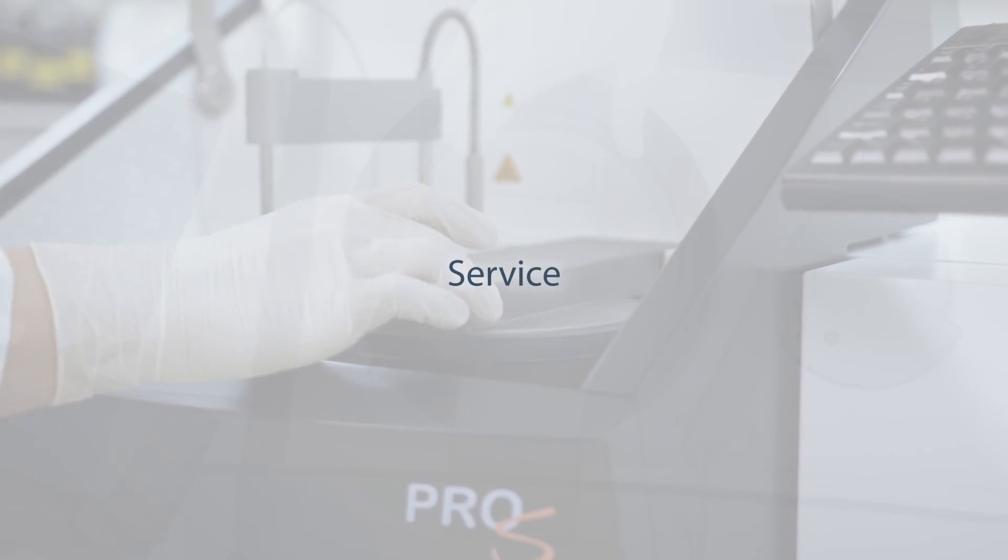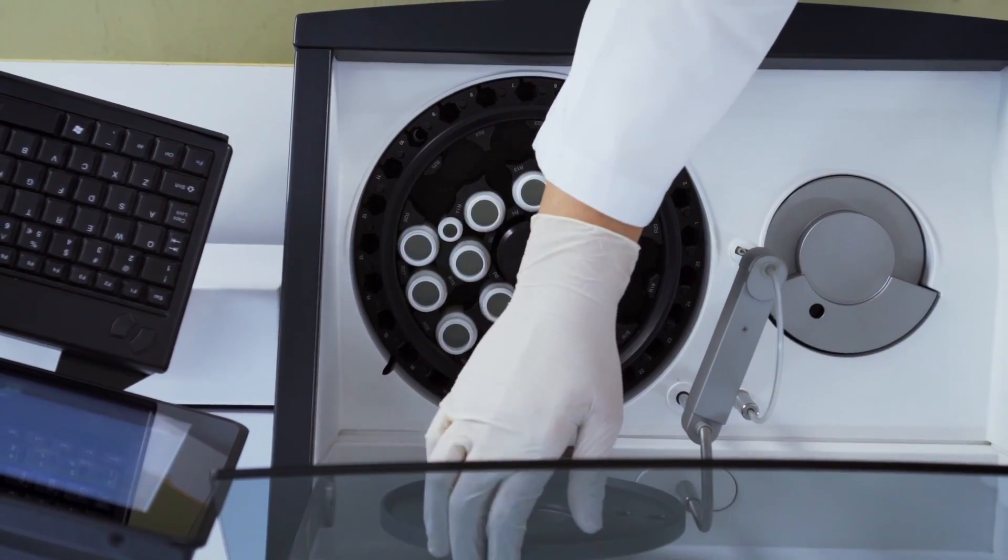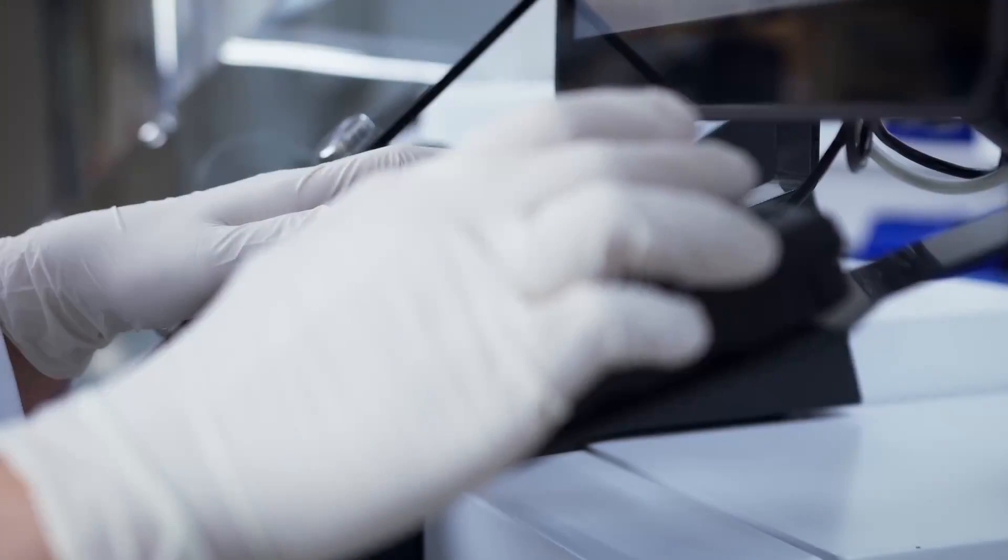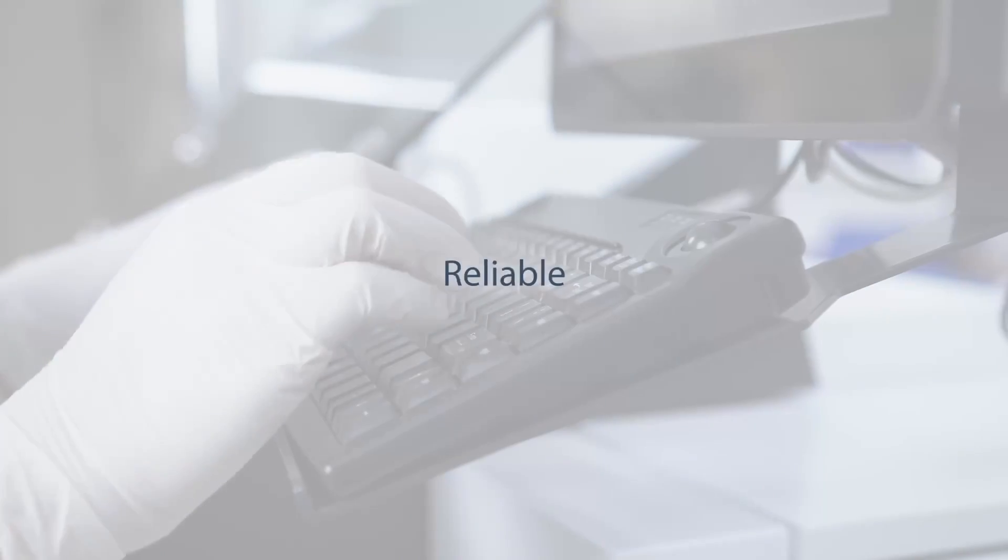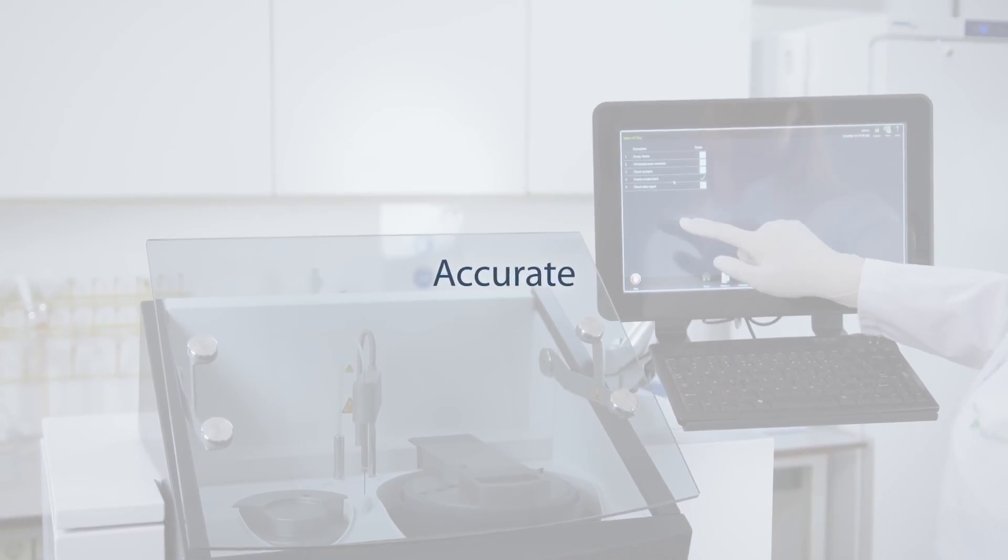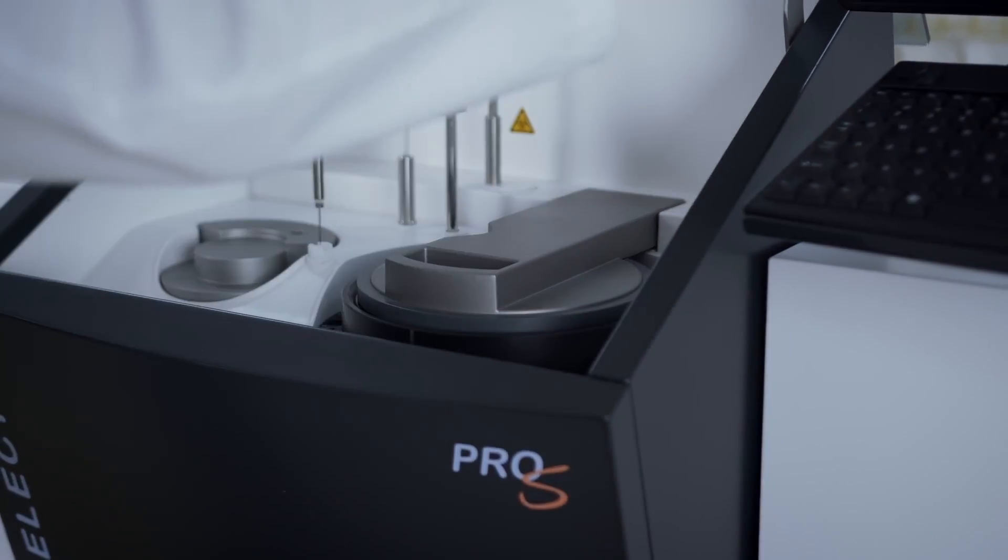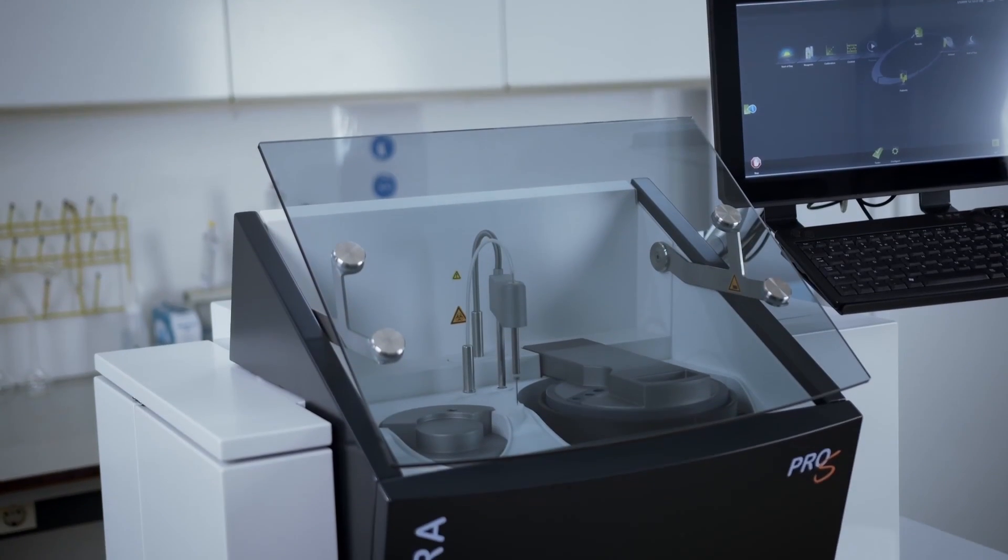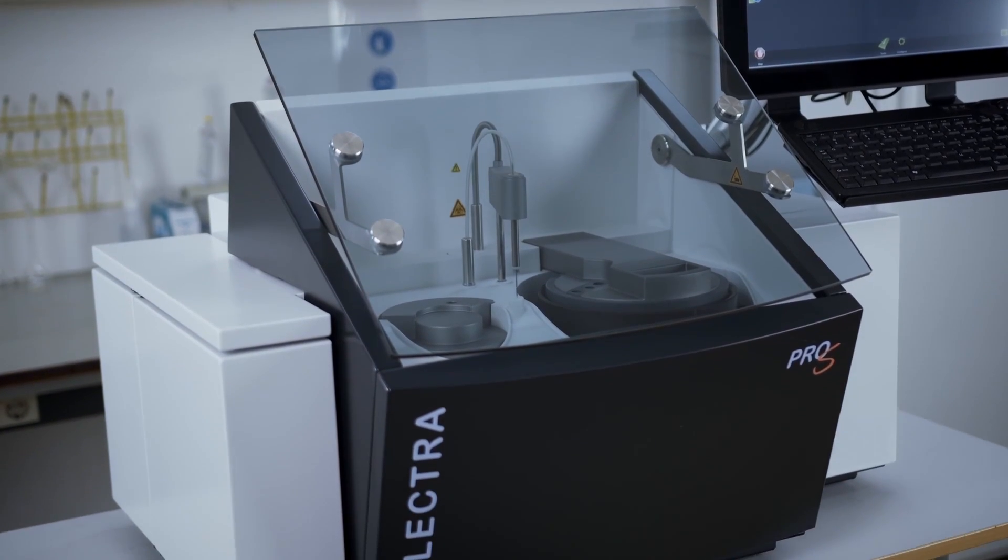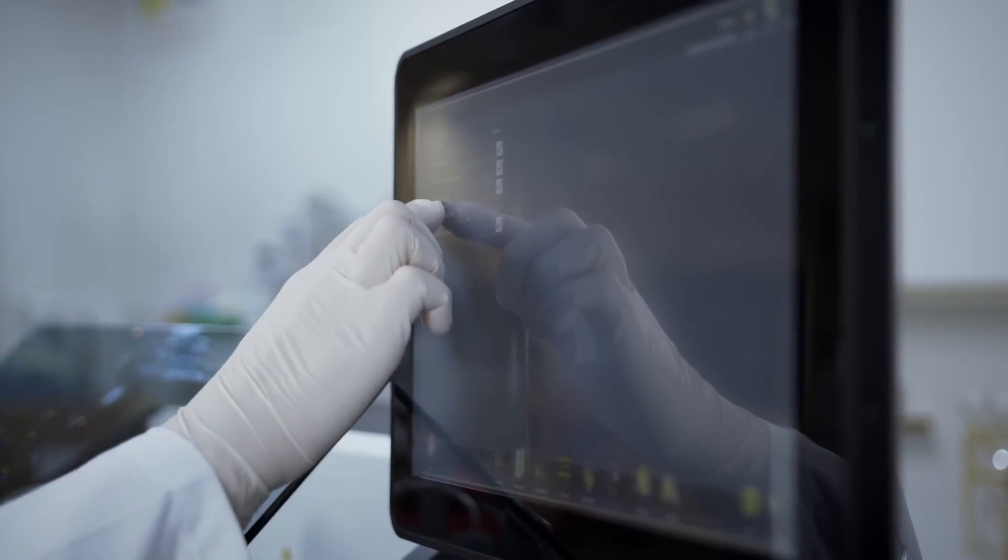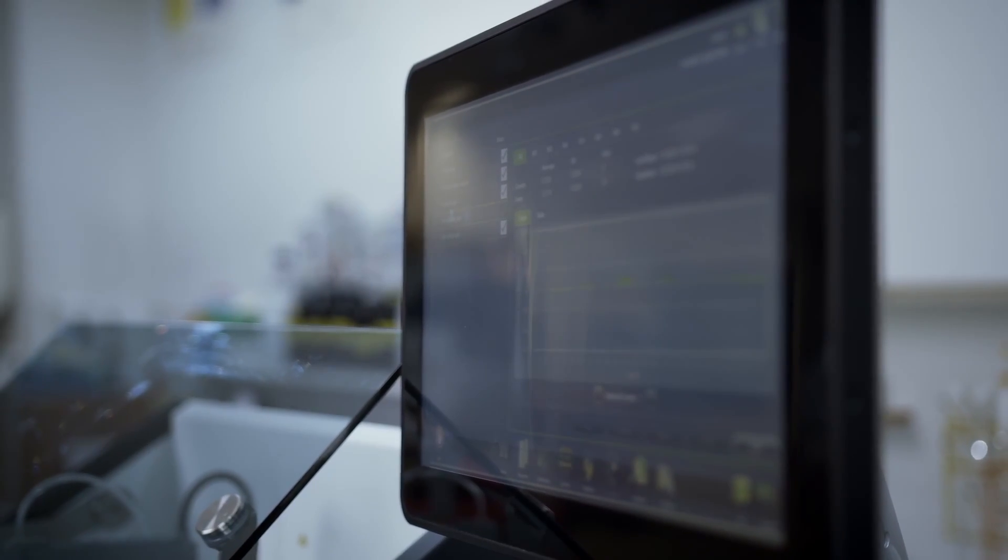Over the years, the Selectra Pro-S has built a solid worldwide reputation for reliable and accurate performance. Together with the broad menu of ready-to-use liquid stable reagents, the Selectra Pro-S provides the laboratory with a state-of-the-art, fully automated chemistry solution with a small footprint.